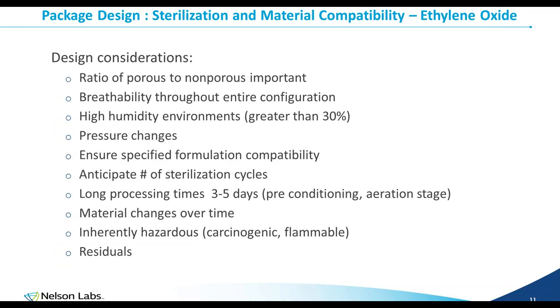Design considerations for packaging that's going to be EO sterilized. You have to have porous material. Ethylene oxide cannot penetrate non-porous materials such as a poly-poly pouch or a foil pouch. So breathability is a factor. It does introduce humidity, sometimes upwards of greater than 30%. There are pressure changes. There's vacuums pulled during the ethylene oxide process.